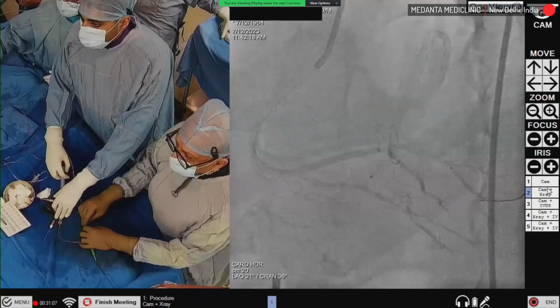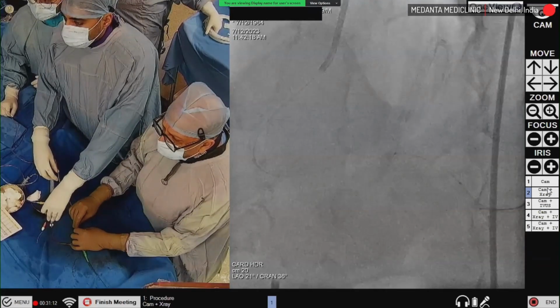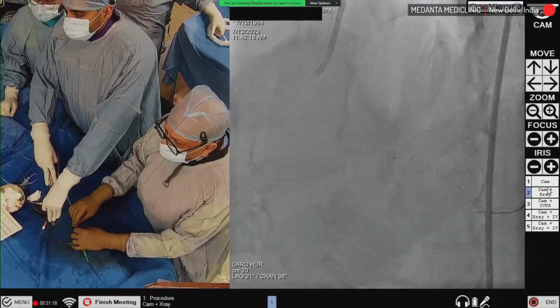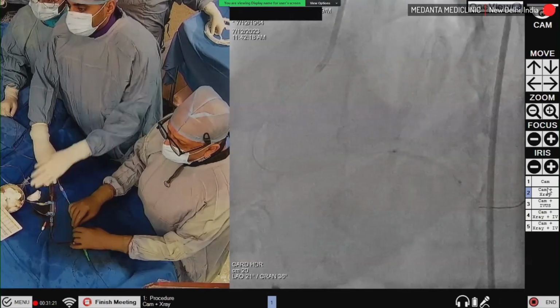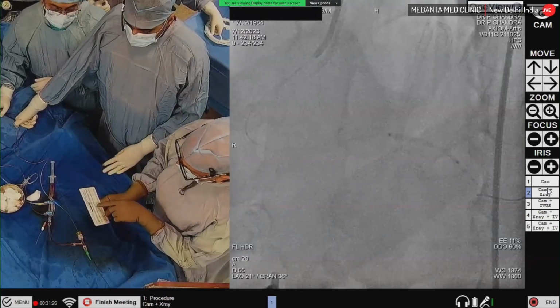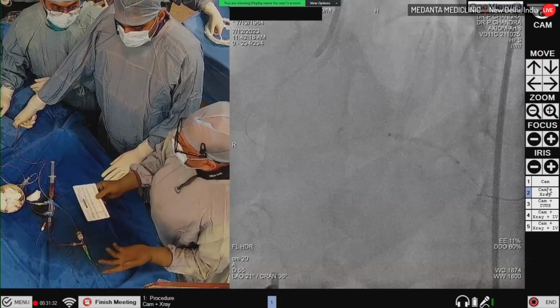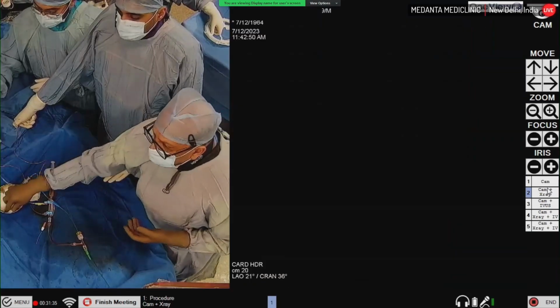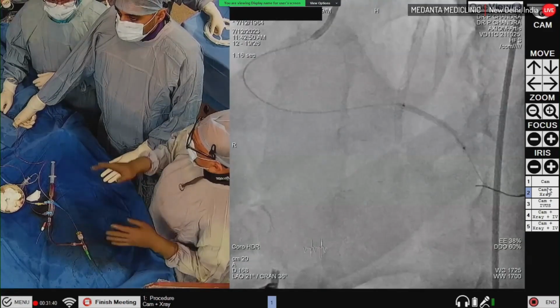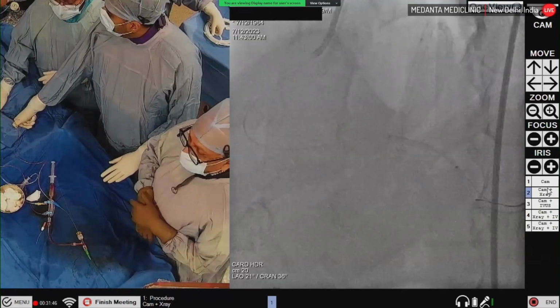Check, please. Okay, I can go a little bit further. Okay, check, please. Yeah, fine. Go up. 1, 2, 3, 4, yeah, 5. So the nominal is 6, and with the 2.25, at 5 atmospheres it is 2.23, and the size looks quite good. The vessel ID was about 2.2 to 2.25, so we are fine. I don't think we need to go any further in terms of pressure.